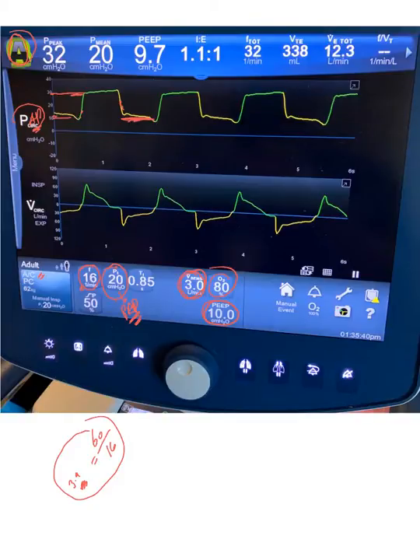During inspiration, the ventilator adds the 20 we asked it to deliver, so the proximal airway pressure goes from 10 to 30. This is a pressure target, and by default the flow in a pressure target, as we explained before, is a decelerating ramp.